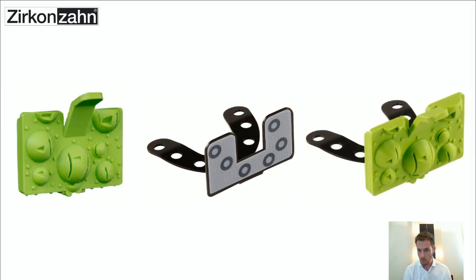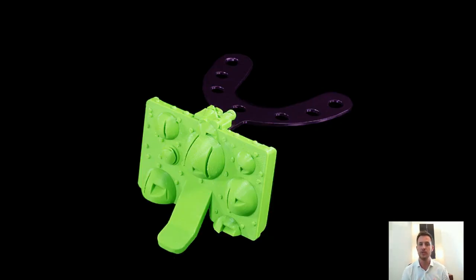And now, what we're doing with this kind of combined instruments, the dentist is able to scan the whole fork with their intraoral scanners. So also, if a doctor is based in the States and the technician is based in Italy, for example me, I don't have to wait anymore until the fork arrives via post. So I can start to work immediately after I receive all necessary data via email. The workflow is similar.